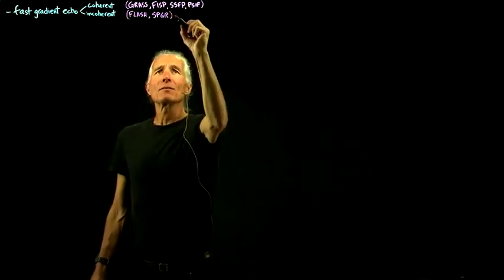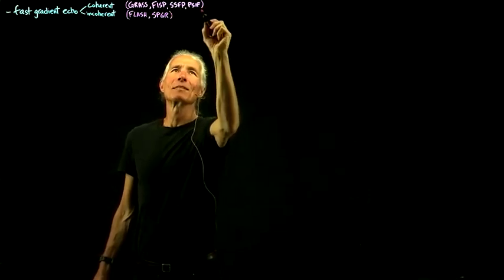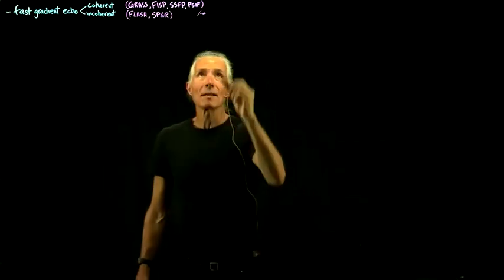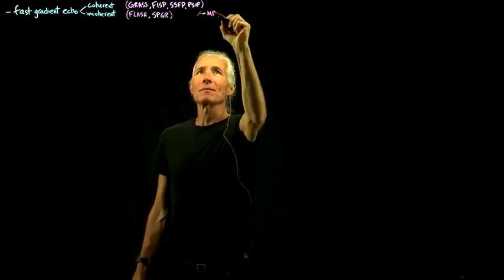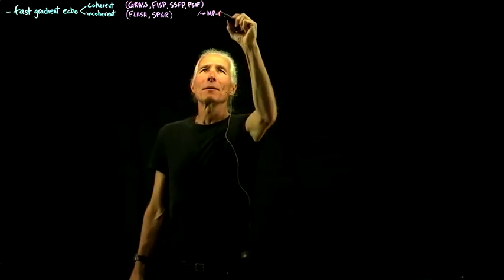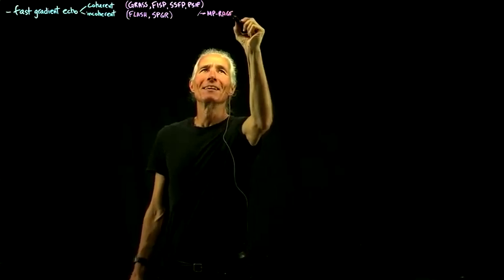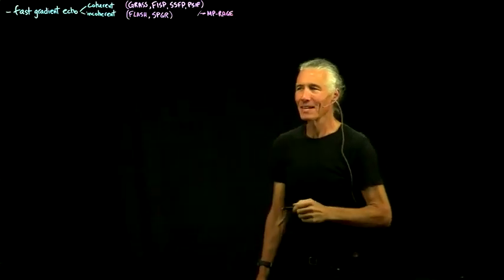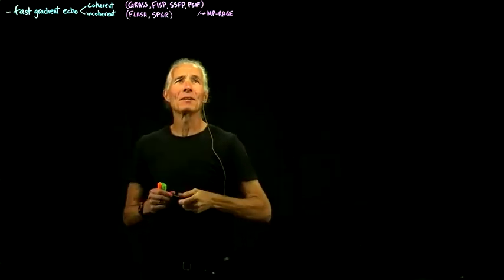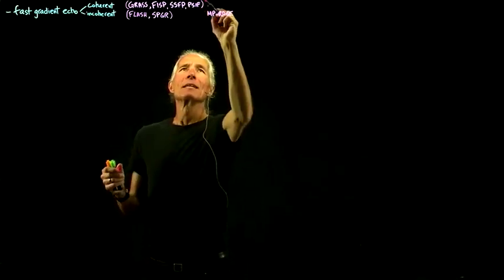But then there's a version of this one, or it's kind of like a combination of both of these two, called MPRAGE, and we'll talk about that. So that one's magnetization prepared rapidly acquired gradient echo. I looked up what it meant. I never knew what it meant. I learned the word without knowing what it meant. And that one's kind of like a different one.